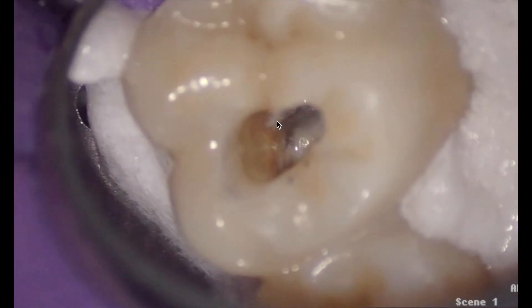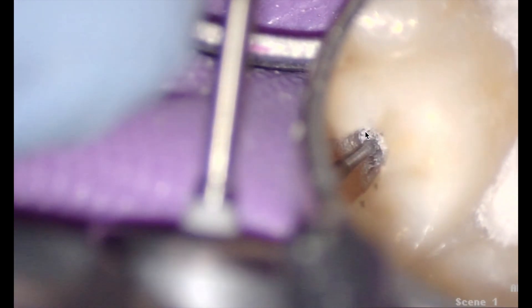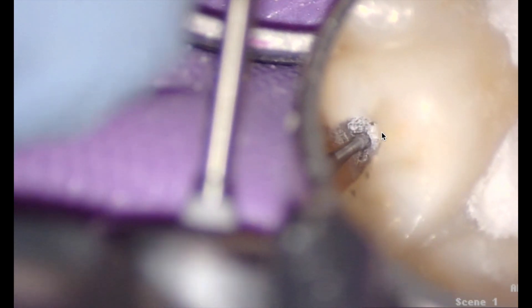At some point you're thinking: is this actually the distal buccal, or is the distal buccal over here? The tooth might be a little bit rotated. So just to prepare — I didn't take a CBCT before, I didn't feel it was necessary. We triangulate, and then I'm going to use a small Muntz burr. I use them like eating with a fork — this is my fork in doing root canals. I'm removing that calcification and pulp stone, troughing towards where I believe the mesial buccal is.